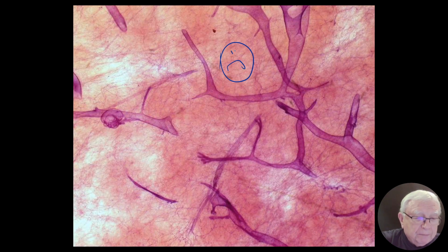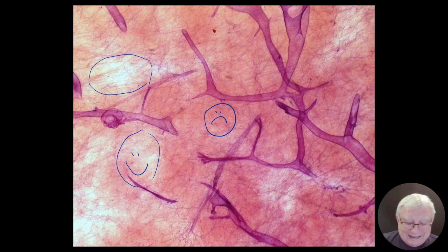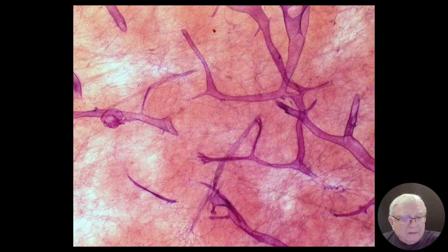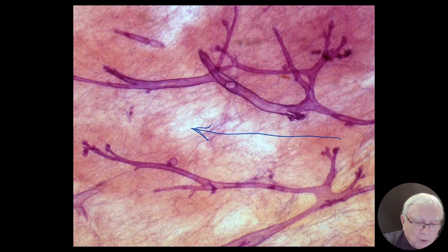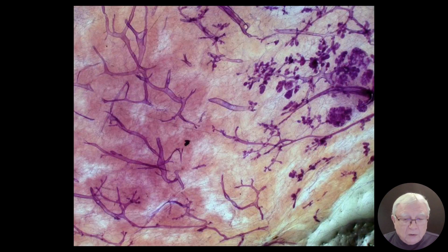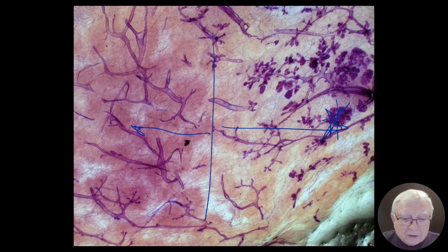Now it's winter time. Well, we radiologists would be very happy about it, but we are not, because there is only so little fat. This is our friend, the red stuff, called dense breast. But then, once again, the breast is not contiguously wintertime here. I'm moving this 10 by 8 centimeter glass with the tissue on it, and look what I find. This half wintertime, this half springtime. And that explains why women with dense breast can get a breast cancer.